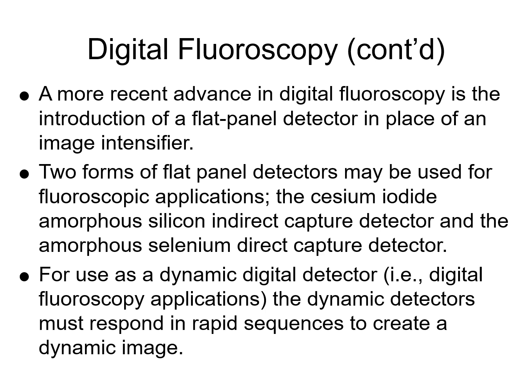And it does prevent blooming better. So the active matrix array is better than the CCD. The flat panel detector is better than the CCD because it's more careful with how it unloads its collected positive charges. It doesn't bunny hop them; it sorts them into their own separate conveyor belts, basically.